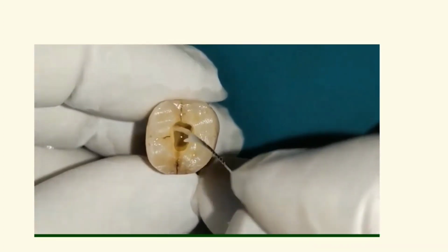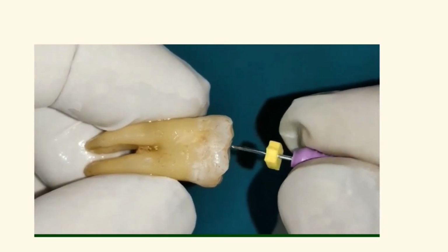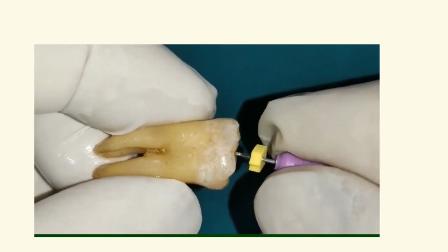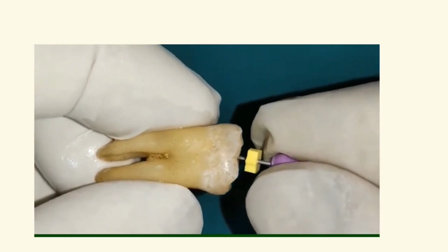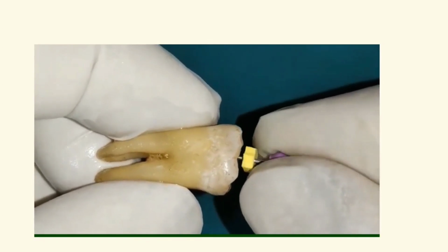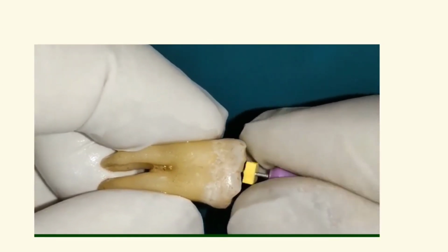Sometimes the file will reach easily to the radiographic terminus, sometimes it won't. Once the file reaches the radiographic terminus, remove the file, irrigate the canal, and shift to the next file. When you get resistance, don't force the file. Remove the file, irrigate the canal, clean the flutes, pre-curve the file again and reinsert it in the canal, slowly advancing apically with watch-winding motion.